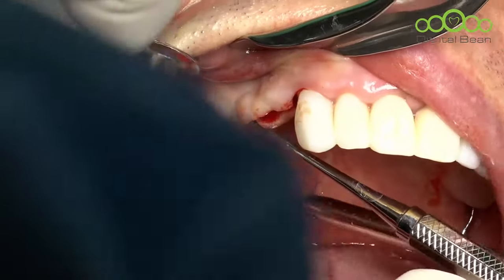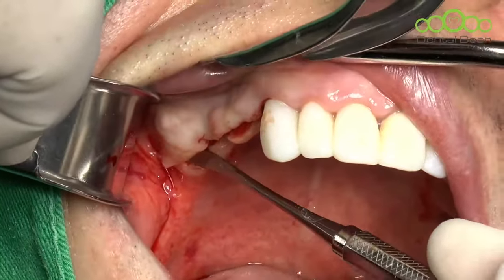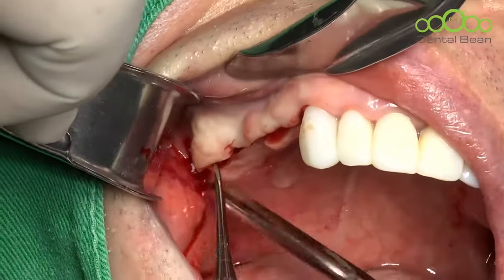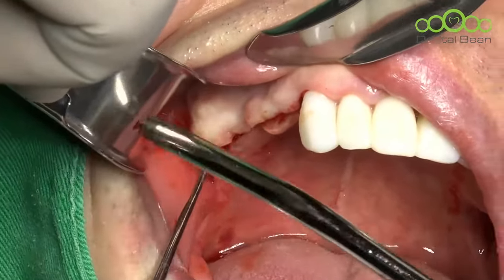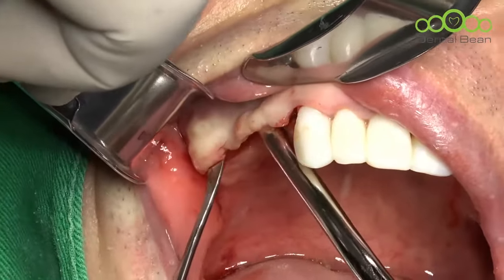double Minnesota. Me and my assistant are using Minnesota retractors. This is very nice. And P24G is the best periosteal elevator. Okay, now it is elevating. Because of the torus, it's not so easy in this portion.